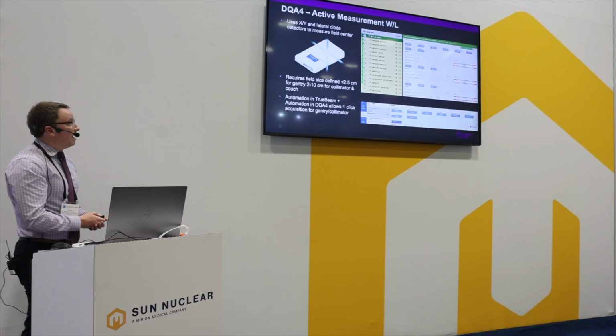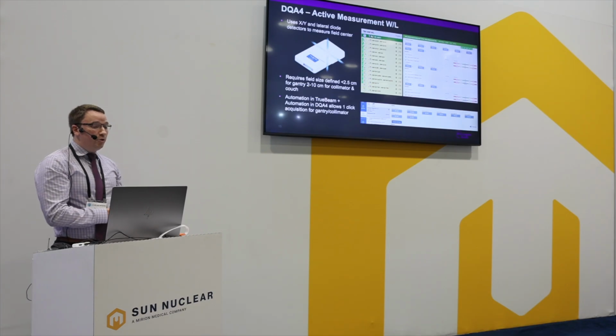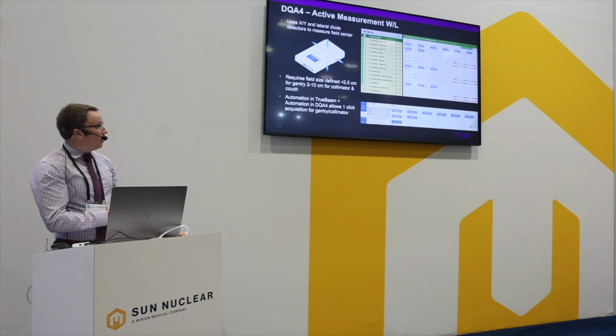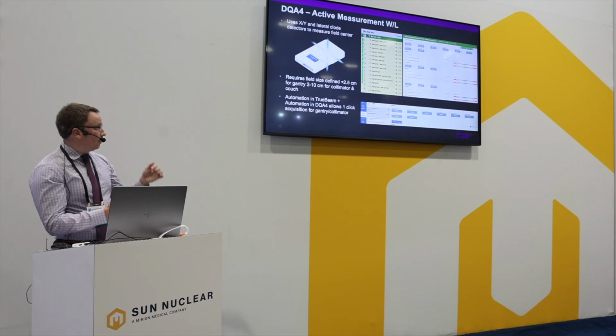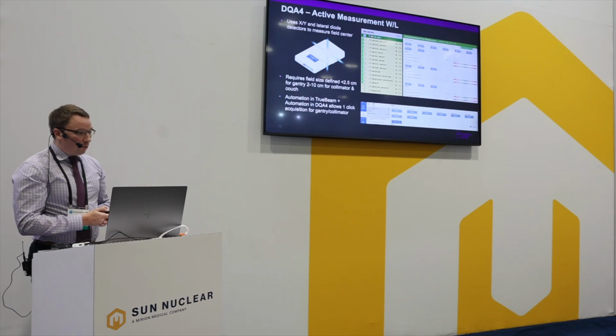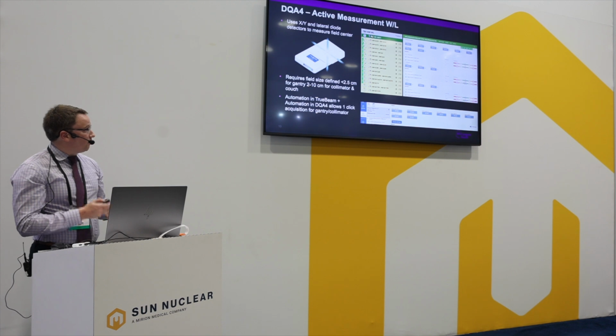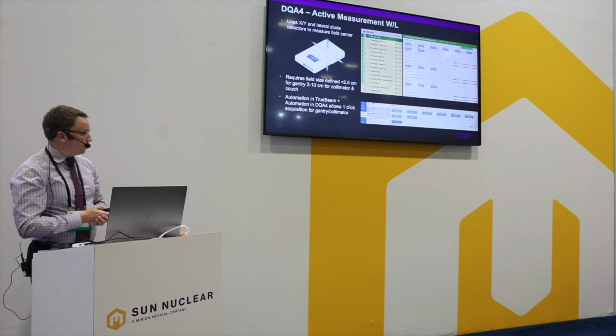So now let's get into the active measurement Winston-Lutz. As Raj pointed out, this is using all the detectors in the array, and you have a choice of irradiating using either 8 gantry angles or 4 gantry angles, or just the cardinal angles, along with collimator rotations and couch rotations. That requires that you use a smaller field size for that gantry to make sure that you don't over-irradiate the side panel detectors, so I used a 2x2 field for all of these.